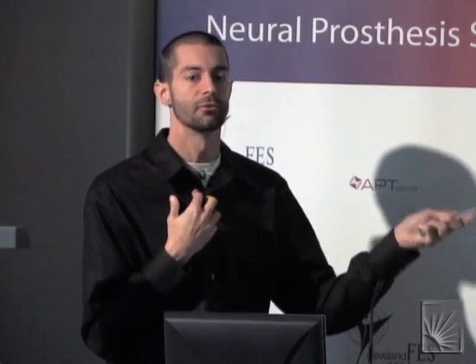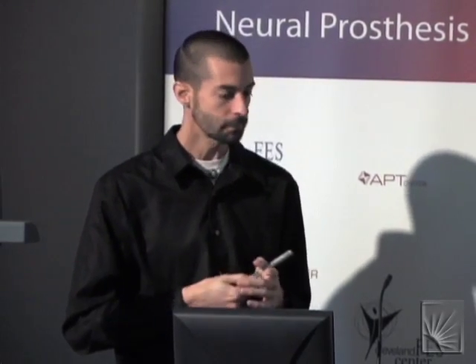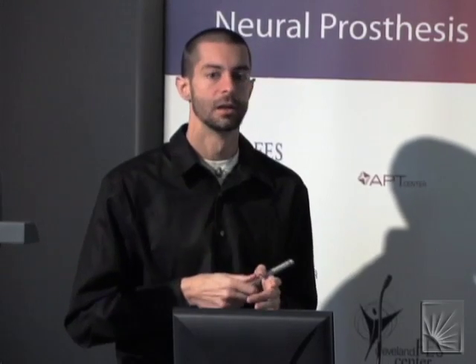We're getting that information for other structures, and then once again you have this secondary inference. And so the brain atlas people that work in this field as their expertise think that these technologies give you plus or minus 1 millimeter. That's the accepted sort of tolerance.